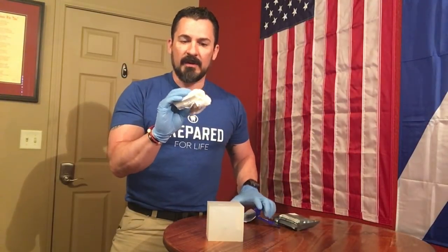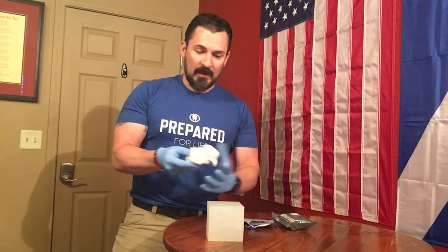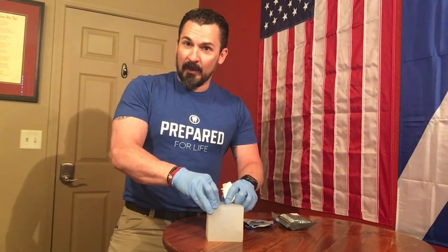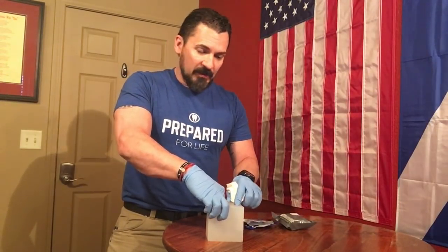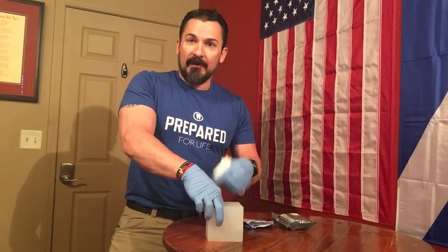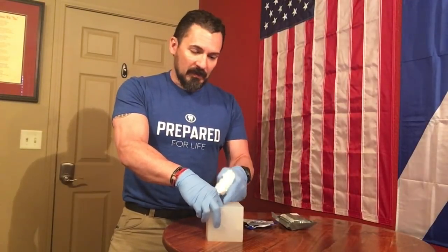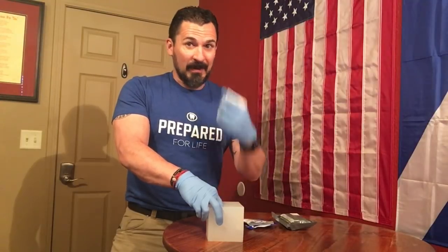Get my wound dressing or my hemostatic dressing out. I like to take it out of the packet. Some people do, some people don't. That's just me. First thing I'm going to do is identify the bleed. I'm going to probe the wound gently with a finger and make sure there's no shrapnel or bone tissue. It's going to hurt the patient. Now, if I've got that finger against the wound, I'm going to feel the bleeding more than likely, especially if it's an arterial bleed. I can actually feel that blood pulse against my finger. Be careful because it can spray out on you as well.